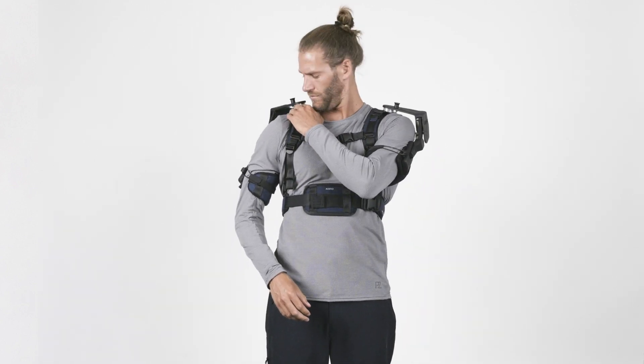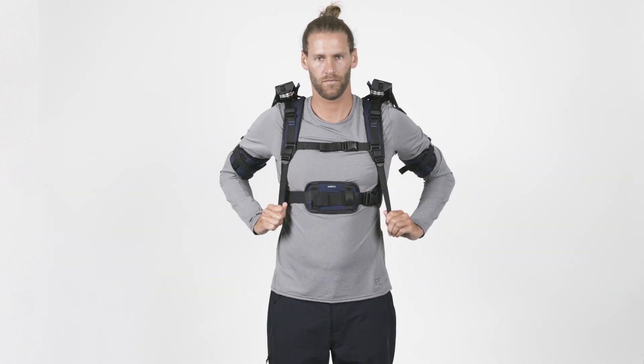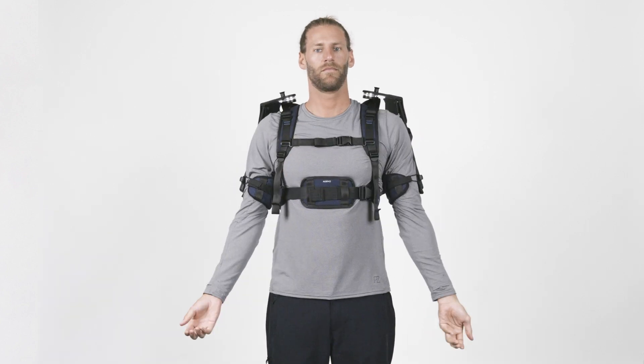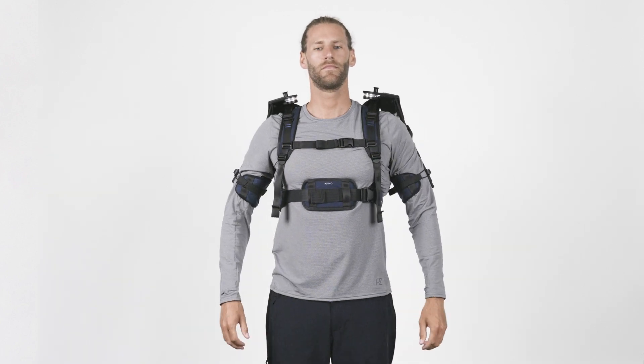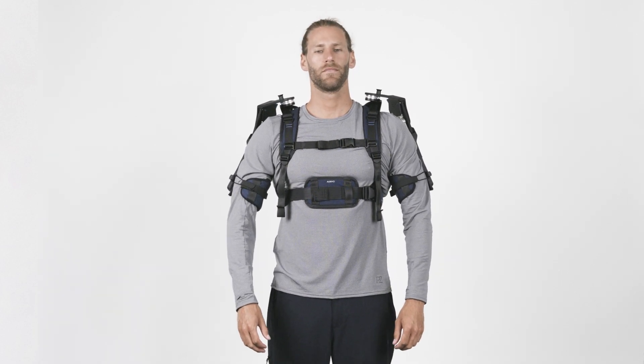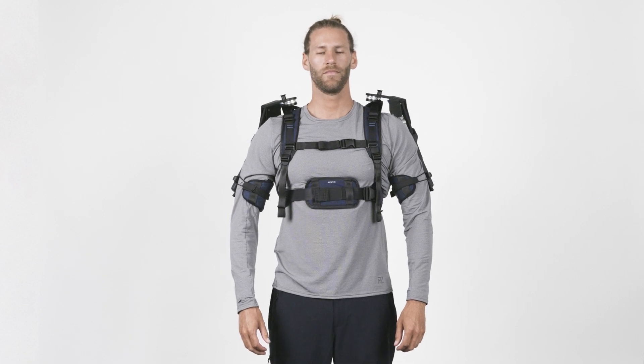If you feel uncomfortable contact at the shoulder when lifting the arms, you can increase the distance by tightening the shoulder straps further. Repeat these steps until you are satisfied with the fitting. We also advise you to readjust the fitting again after some use to compensate for minor shifting of the exoskeleton on your body.